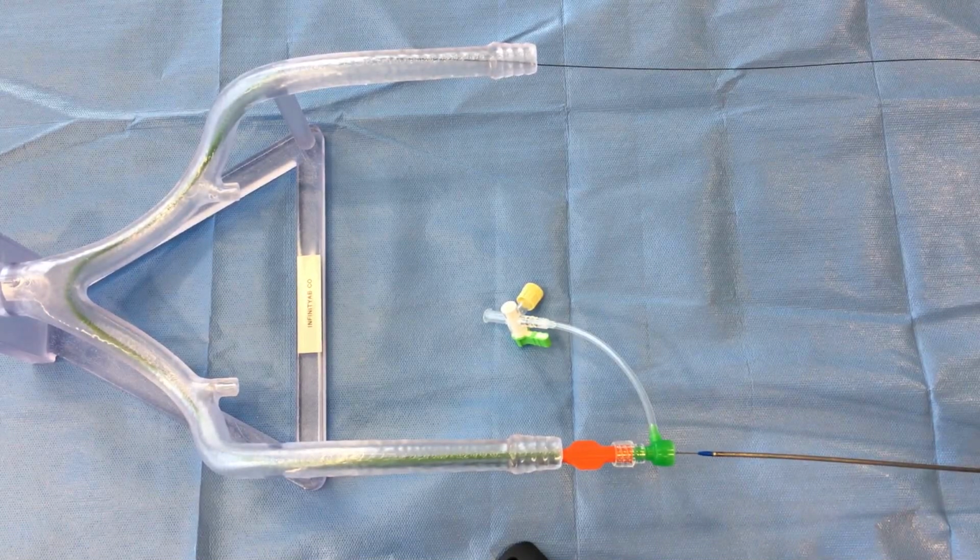In this demonstration, an aortic bifurcation model with significant tortuosity is demonstrated. The sheath has been advanced across the aortic bifurcation, and a guide wire has been placed as would normally be done in a contralateral access. The guide wire is simulated to be down the contralateral femoral artery. The Infinity tip is ready to be inserted into the procedural sheath.